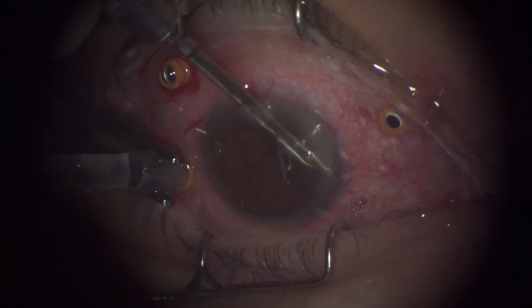And we exchange PFO for silicone oil in a direct fashion, and you see no slippage. The retina is fully attached, and we grab all the drops from the retinal periphery as well, and we don't leave the eye with any PFO actually. See the last drop being taken.